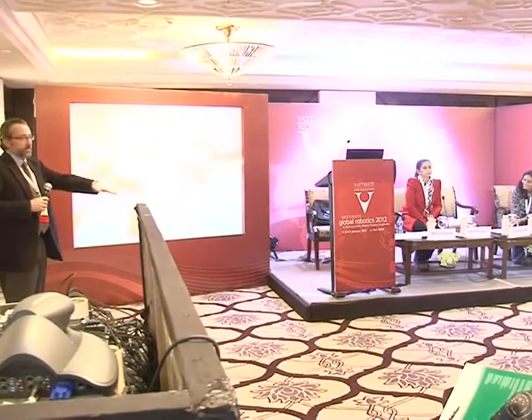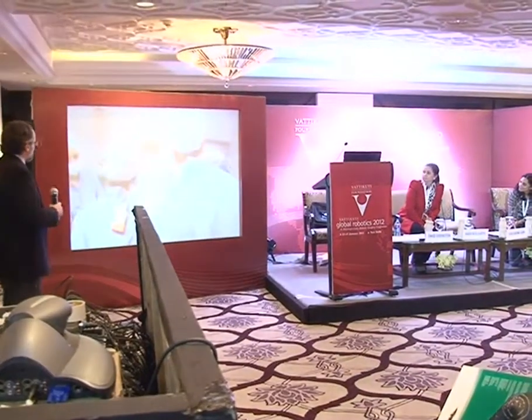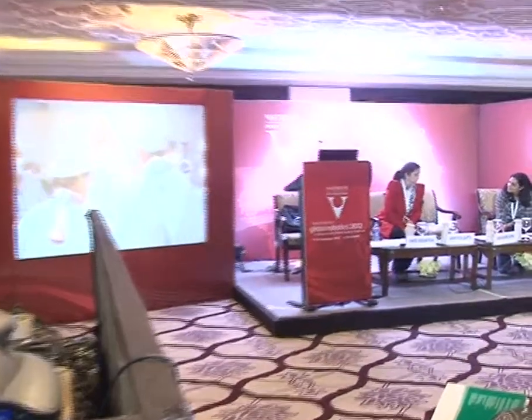get the fourth arm in here. She's very petite, so it's going to be a little tight, I think, with her, but I think we can make it work. Got the uterus pushed in.